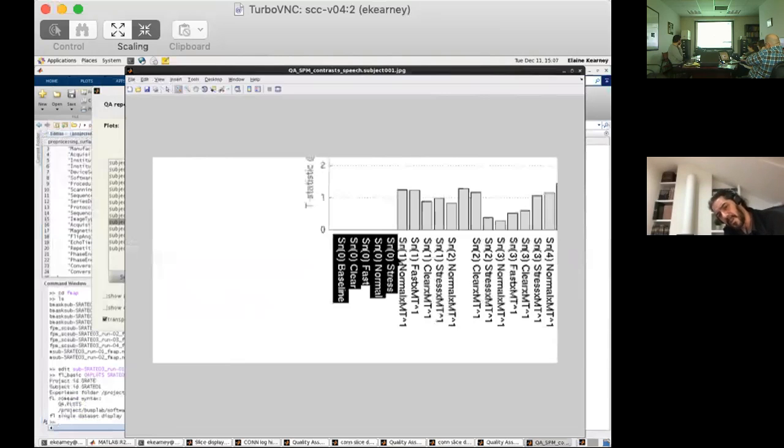So all of these things are probably related to how, at the end of the design matrix, you include a session-specific average. So you are disregarding anything that is happening on average across all of the time points, across all of the scans, right? So all of these 5 things are dependent on that baseline, or average level. They can be compared to one another, but you cannot tell anything about their actual height unless you contrast it to that session-specific average. I don't know if I'm being too clear.